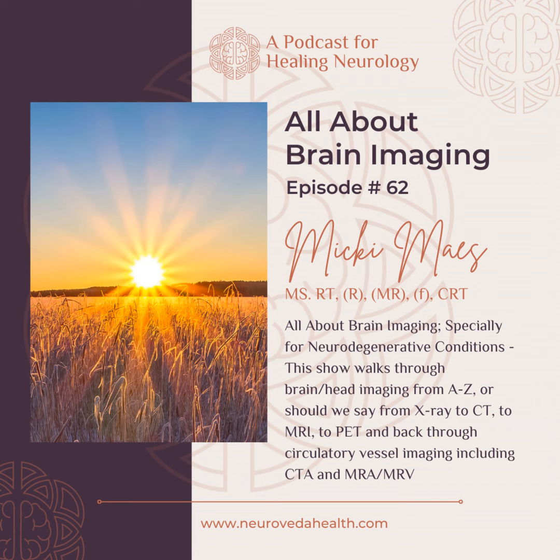So these are all tipping and we're using all this water. So if there's an area in the body that's cancerous, it's going to have a different rate of perfusion of that water flow through it. So we capitalize on that with the gadolinium, and we can see those areas light up as that gadolinium infusion is either at a faster rate or slower rate, depending on what the disease process is.